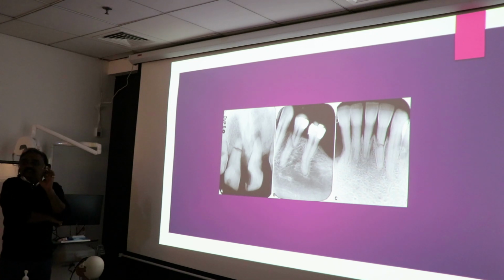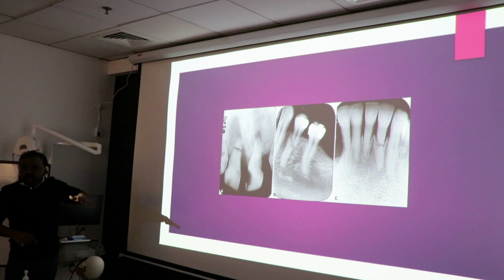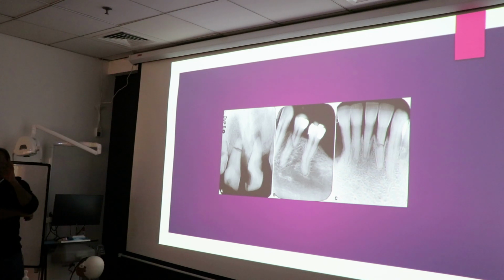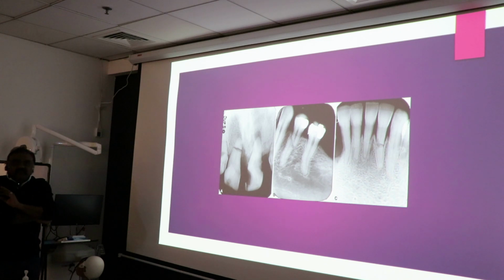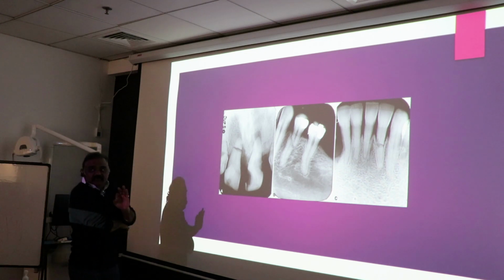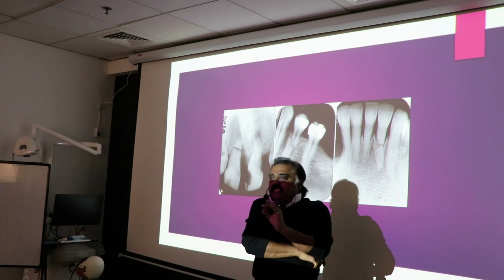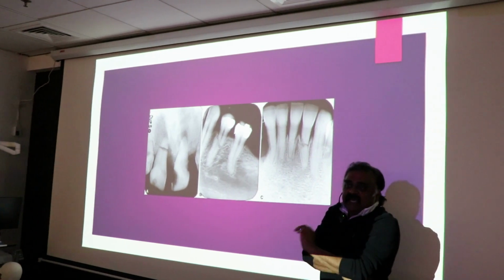So in orthodontia, there are two types of extrusion. One is orthodontic extrusion, which is done in a very, very slow manner. When you want the bone and when you want the soft tissue to move along with the tooth, it has to be slow. So you should have the patience to go through the orthodontic treatment to make sure that it is a slow process. As was rightly pointed out, he said 0.5 millimeters, but let me tell you, there is no hard and fast rule as to what should be the time frame for you to move the tooth in the vertical dimension to make sure that you get adequate bone and the soft tissue contour to help you in replacing the tooth.